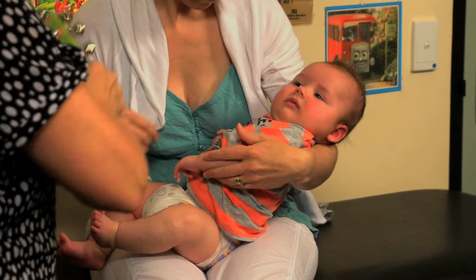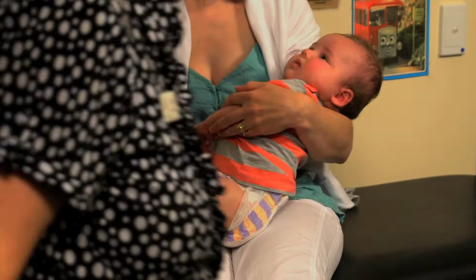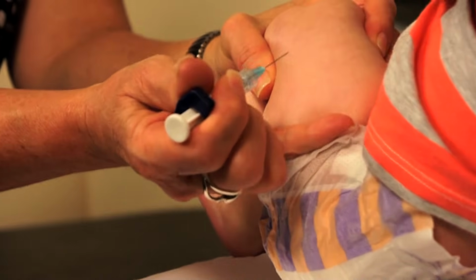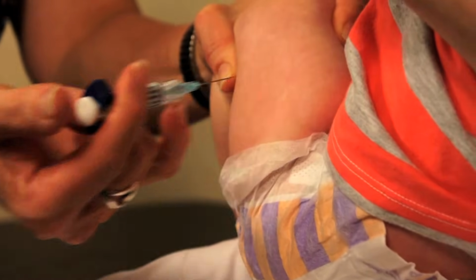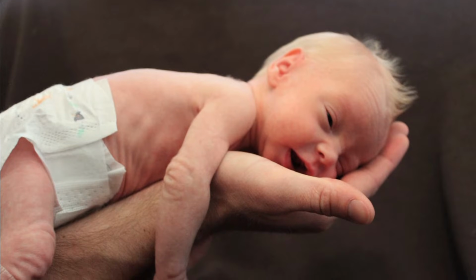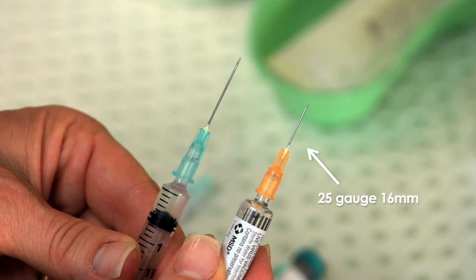Here is another child receiving their 4-month vaccines. Note how the nurse gently lifts and turns the baby to expose the thigh. This makes it easier to identify anatomical landmarks and administer the injection. Some babies have nice large thighs for vaccinating. However, if you are administering the hepatitis B vaccine to a newborn or the 2-month vaccines to a premature baby, you will notice a smaller muscle mass. The 25 gauge 16mm needle is recommended. If you are using the 25 gauge needle, make sure you inject the vaccine slowly over 5 seconds to reduce injection pain and muscle trauma.